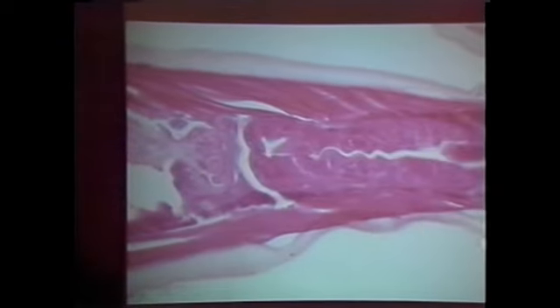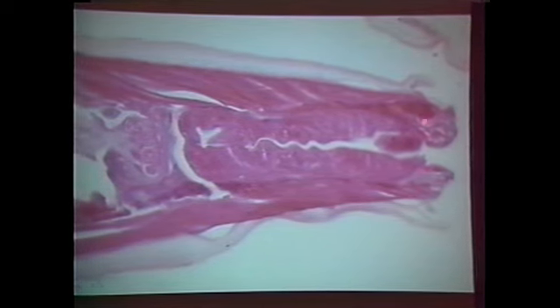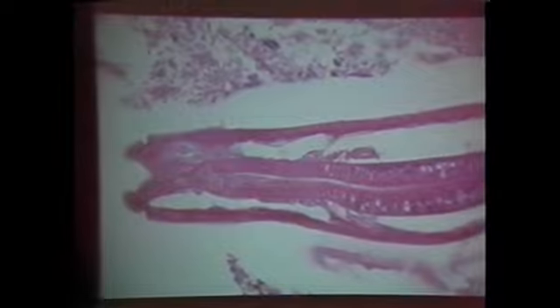The cuticle at the mouth of the worm is sometimes different. This is a strongyle mouth. Think of it like a hookworm, if you will. It isn't a hookworm, but it's kind of like that chitinized buccal cavity, you see? And sometimes, this is Physaloptera. It has that nice little piece of cuticle that comes out and forms that dome around the lips. And you can see those in your tissue sections.